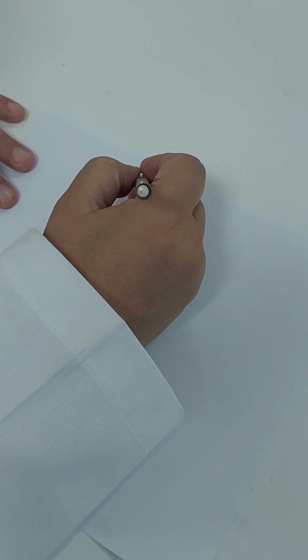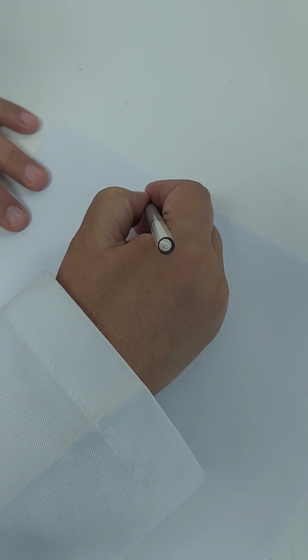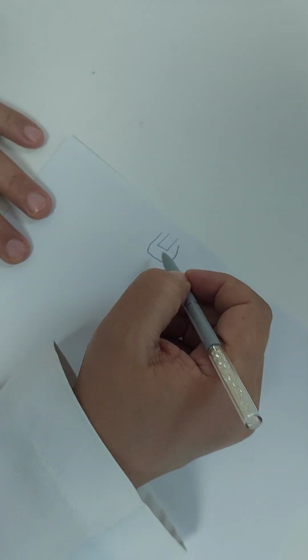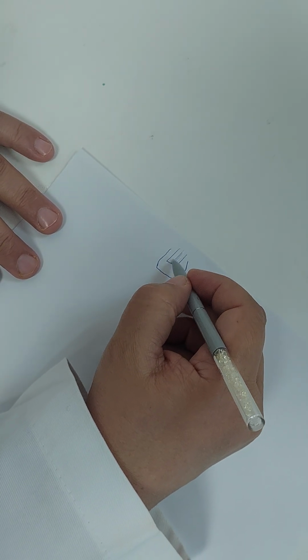The patient had multiple anterior teeth being crowned, and the material being crowned with was Emax. The patient had previously had an endodontic treatment for the core of the tooth. So the tooth has been endodontically treated. It still has enough ferrule of dentine, but the tooth is discolored.